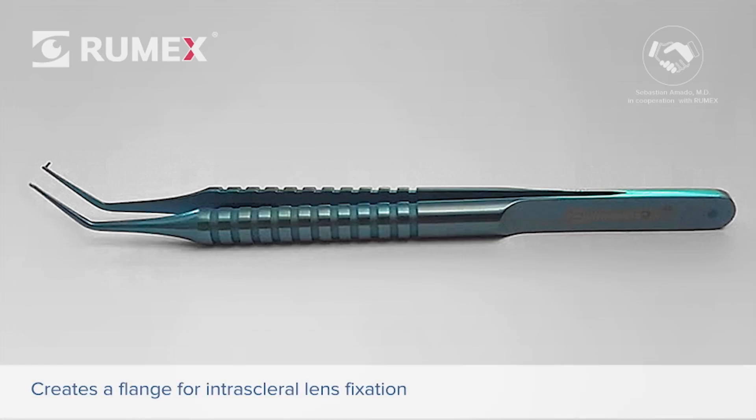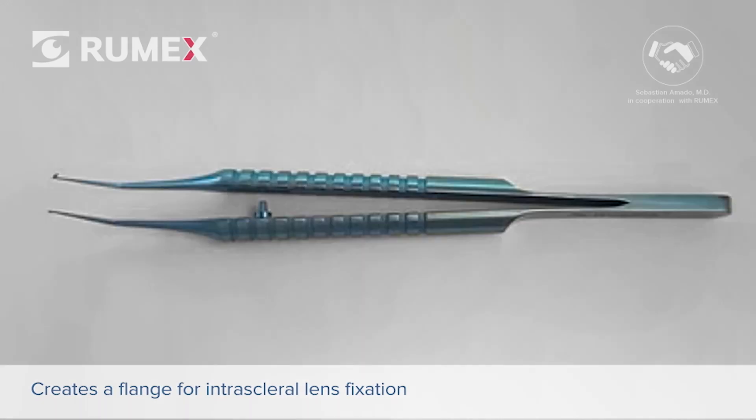Introducing the Perfect Flanger Forceps. This is a new titanium forceps specifically designed for flange creation when performing an IOL scleral fixation technique, such as the Yamani technique and its variants.